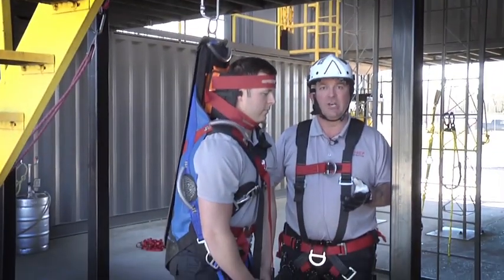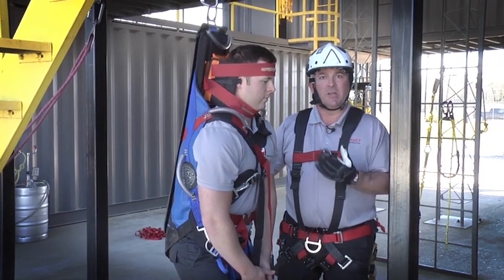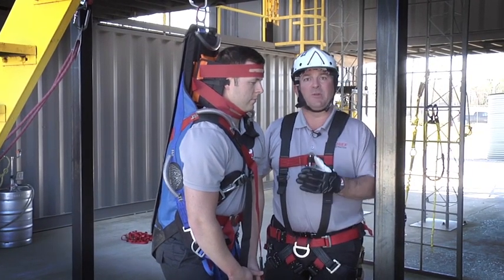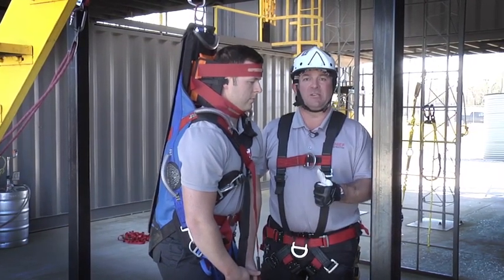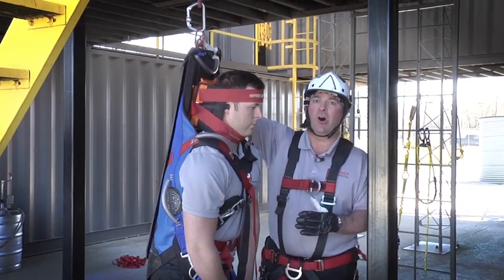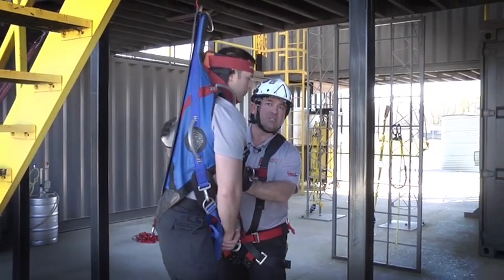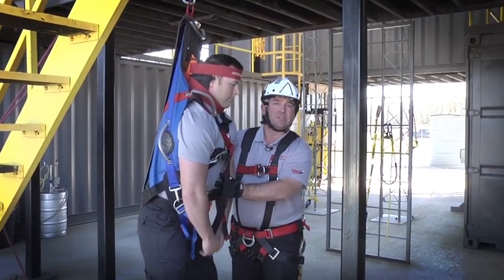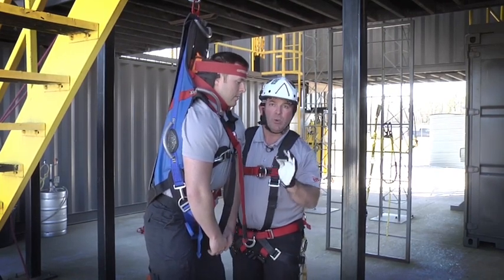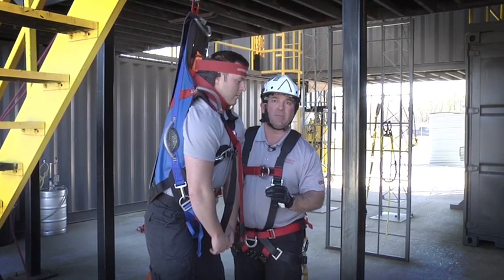Let's talk about the lifting connections on the SpecPak. Not only does it offer C-spine protection, but it's also a class 3 rated harness. So if we have a snatch-and-grab situation, we can put this harness on and just get them out of the space quickly. The first connection point is the bull ring up here at the top. As we haul on this patient and they suspend from it, notice the angle of the patient — it's very similar to somebody hanging from their fall protection with that forward angle. With this happening, we want to limit the hang time to 5 to 7 minutes due to the quick onset of suspension trauma.